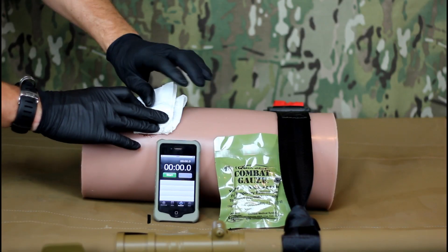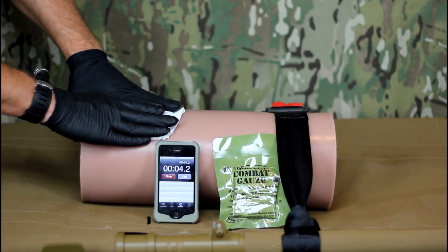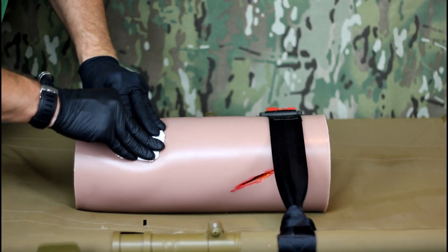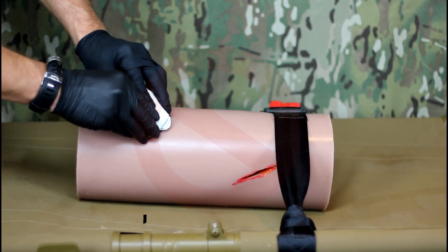Once the wound is fully packed, use any excess gauze to continue to apply pressure over the wound for at least three minutes. It is important to maintain consistent pressure. Do not push up and down on the wound or move the gauze unnecessarily.